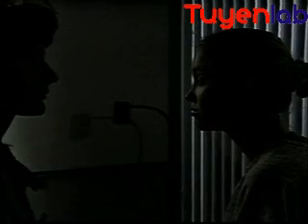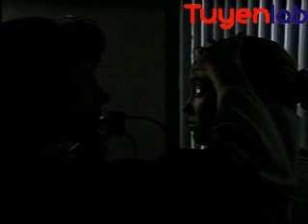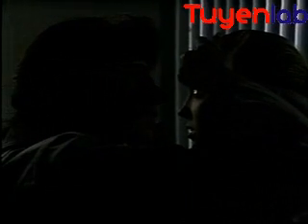From 15 inches away and 15 degrees lateral to the patient's line of vision, shine the light beam on the pupil. Locate the red reflex, which should appear as an orange glow in the pupil. Note any opacities that interrupt the red reflex.